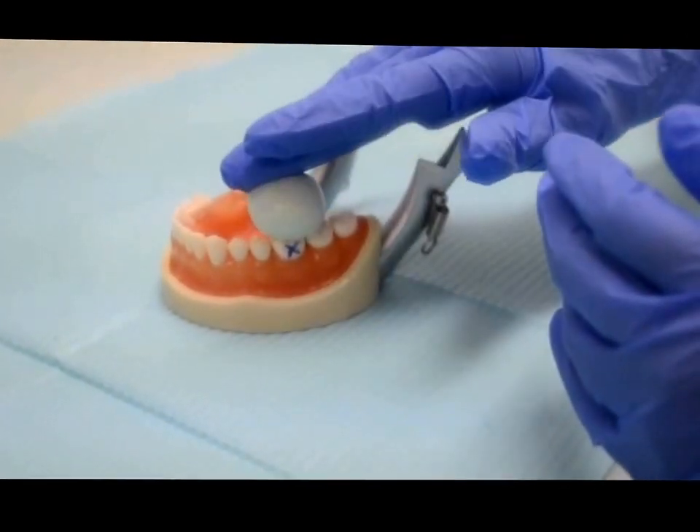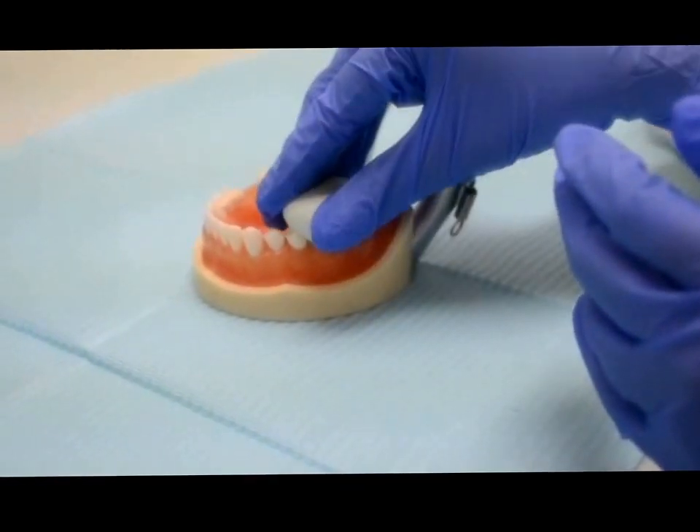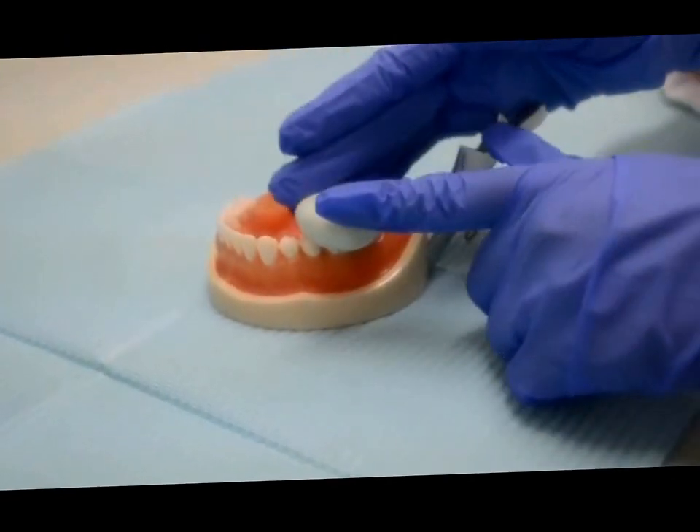With gentle pressure, apply the putty on the unprepared teeth and extend at least one tooth on either side.